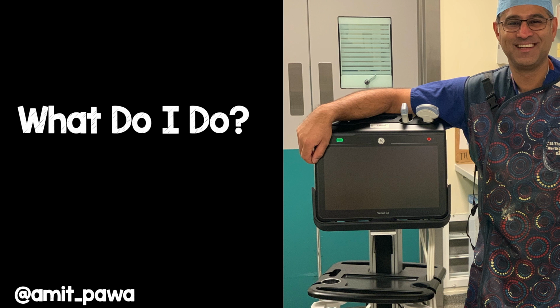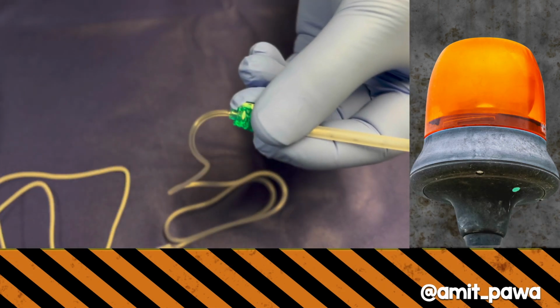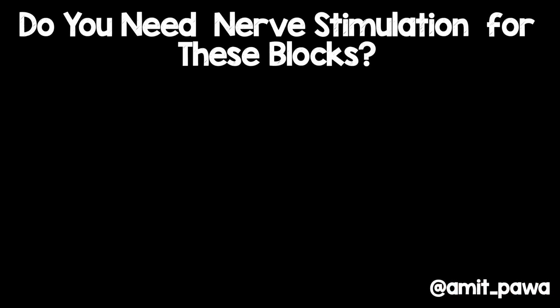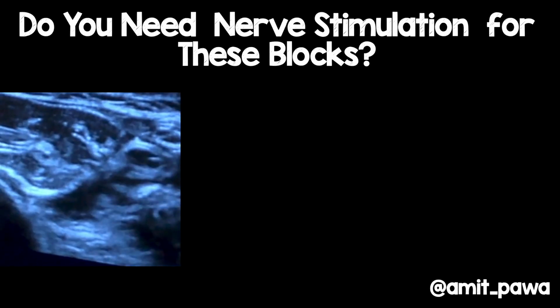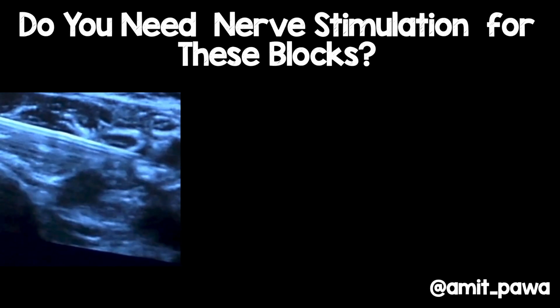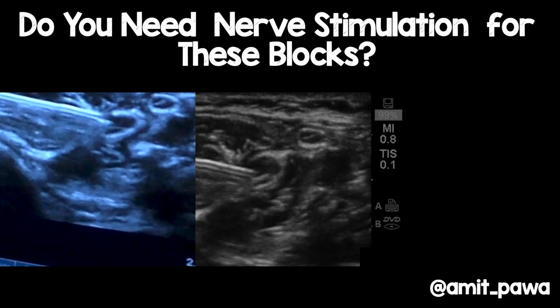So what do we do? Now I'm going to give you a bit of a heads up here. This comes with a trigger warning, Jeff, so this is what I do. I take the needle, I pull off the wire, look how clean and pristine that is. So now I'm going to challenge you. I'm going to show you a few videos here, and I want you to tell me whether you think you need nerve stimulation to work out whether this practice is safe or not, or whether the injections are intraneural.